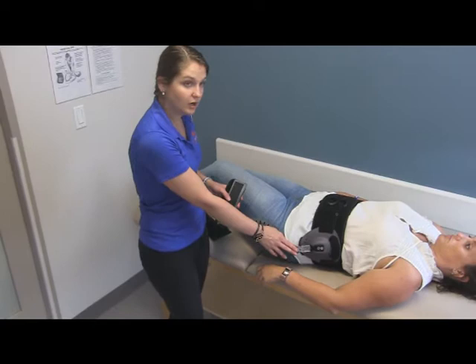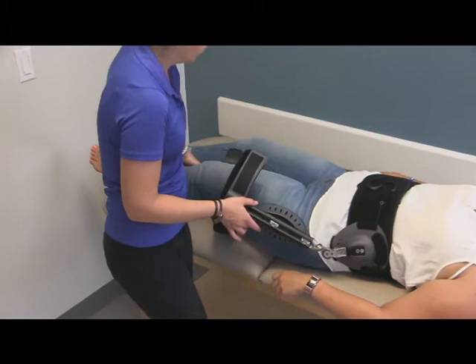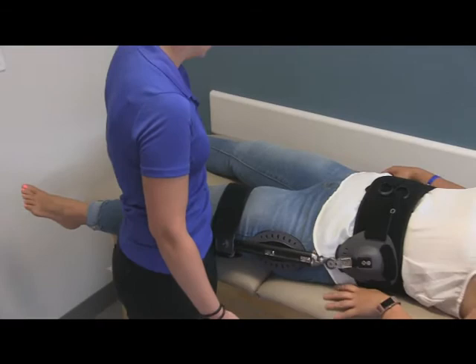Your orthotist has already adjusted the angle of the joint here per your doctor's orders, so you do not need to make any adjustments to the joint or any of the screws. The next step is to get the thigh portion wrapped around the patient's mid thigh. Her hip should be abducted, so it should be out to the side. This gets wrapped around and strapped into place using the velcro strap.